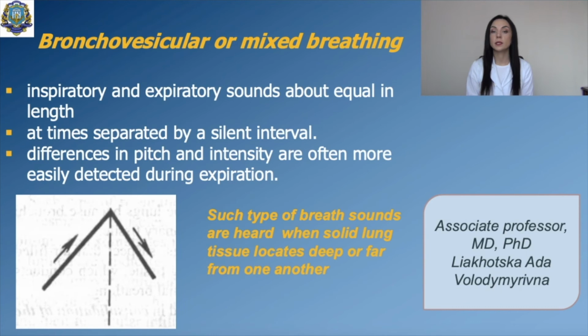Bronchovesicular or mixed breathing. Inspiratory and expiratory sounds are about equal in length, at times separated by a silent interval, and differences in pitch and intensity are often more easily detected during expiration. Such type of breath sounds are heard when solid lung tissue is located deep or far from one another. Let's hear.